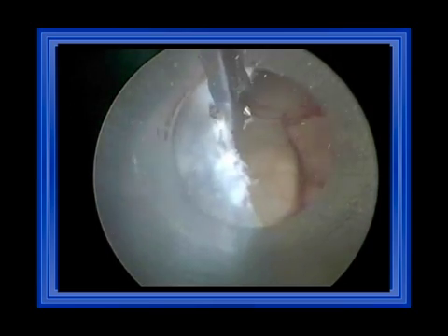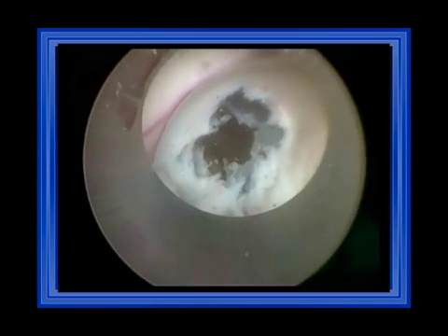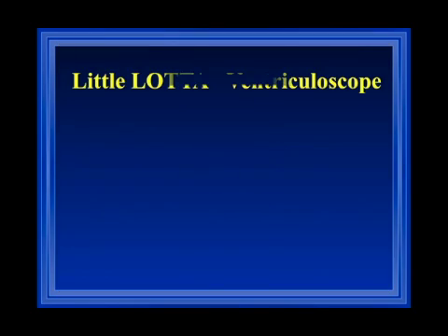This small video shows the application of the scope during a fenestration of an arachnoid cyst within the cavum septi pellucidi. You can see the sheath keeps the brain tissue away, and I have only the arachnoid membrane which I can cut directly working within the sheath. The sheath provides a working space and also protects the surrounding brain tissue — that's why I like to have it.